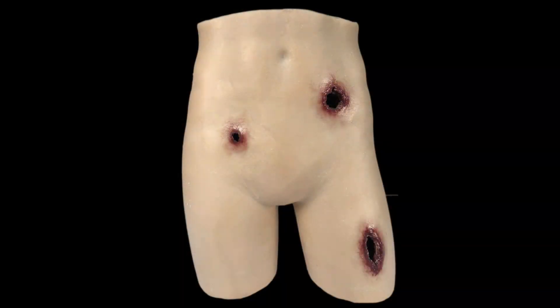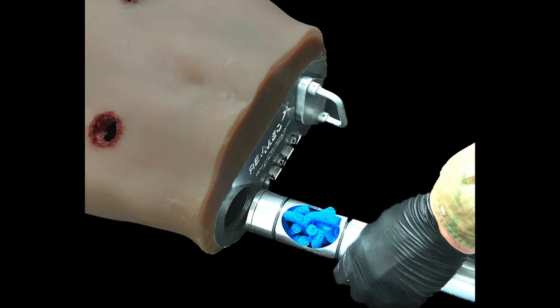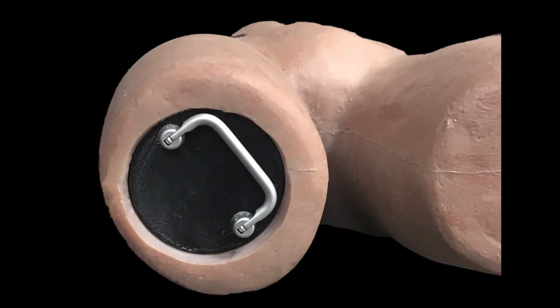The key features of the Multi-Task Training Mannequin are its realistic entry and exit wounds, synthetic arteries for simulated bleeding, an internal cylinder system for easy removal of extant sponges, and a convenient storage compartment.